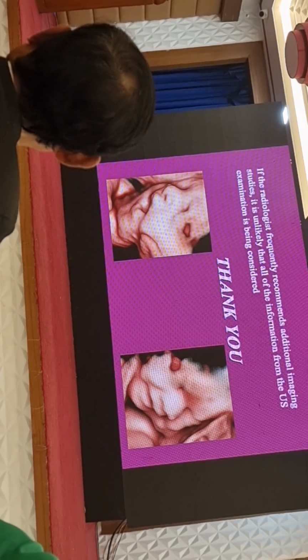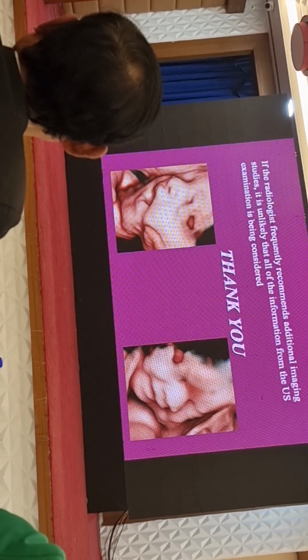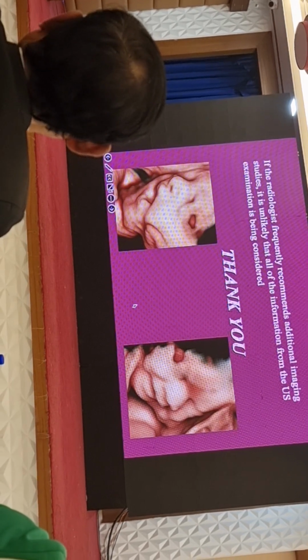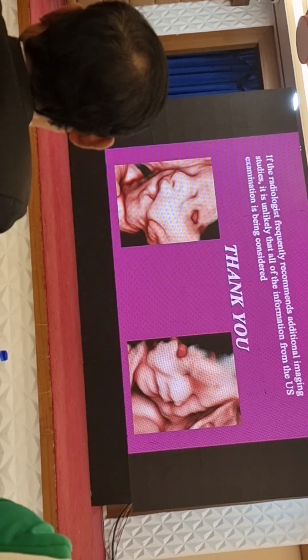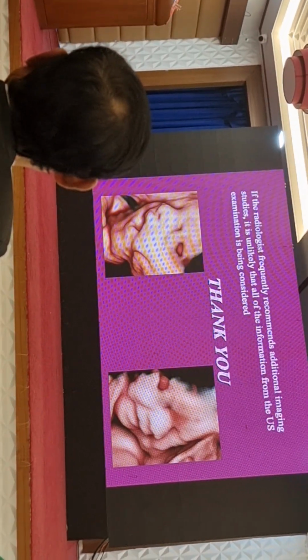And the only other thing is timing of the scan. If we scan them appropriately at the mid-cycle, we get better results. And I always feel if the radiologist recommends too many additional images, it is unlikely that the information of ultrasound is being used. I hope I didn't put you off to sleep.